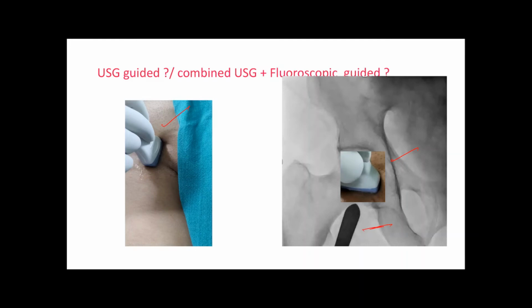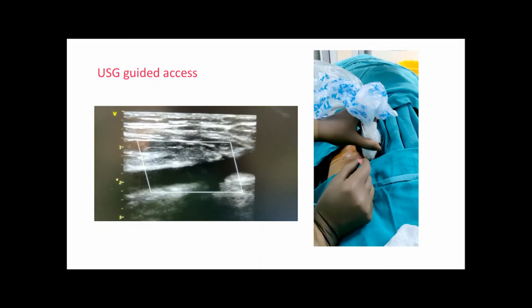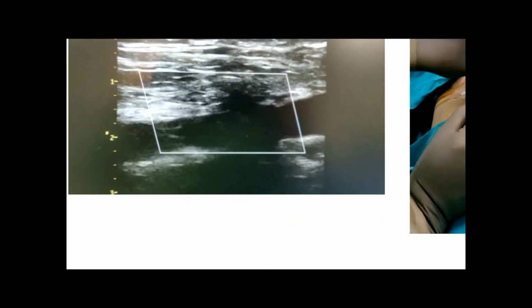So what fluoroscopic guidance will give you is the exact skin site where you are going to enter the needle, and you put the probe there and you see the bifurcation and see the local anatomy. You can see whether there is a calcification or atherosclerotic plaque over the artery, and you can thereby modify your puncture depth, puncture height, at the site where you are entering the common femoral artery. So I'll just discuss a case with you of how you actually go about it.